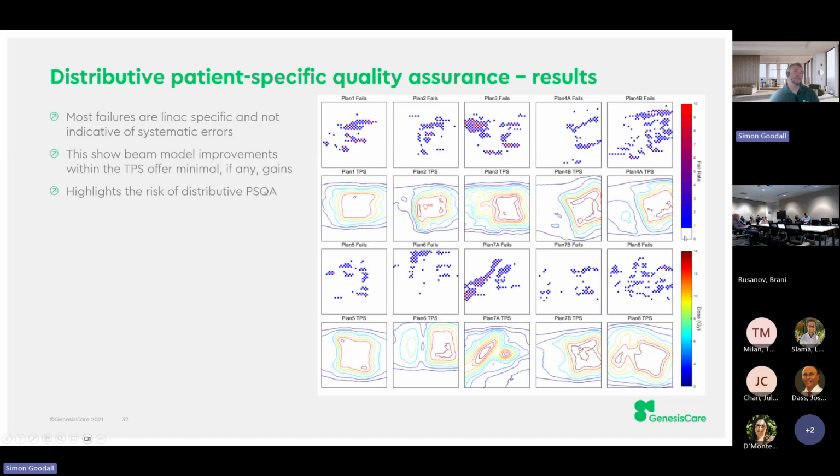All these areas where we've got the blue markers where only 1 or 2 LINACs failed is showing a variation in LINAC distributions, and these are inter-LINAC variabilities which we might be able to solve by increased matching. But they're the points that we worry about in a distributive QA model. The bits where everything fails every time is actually not such a problem, because it means we're not going to get our false passes. But generally we can see that most things are LINAC specific.